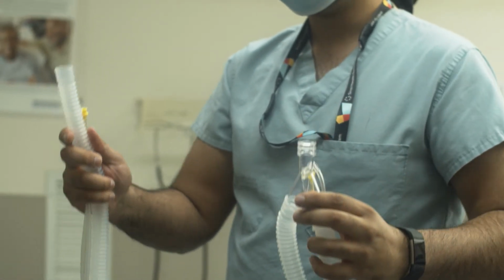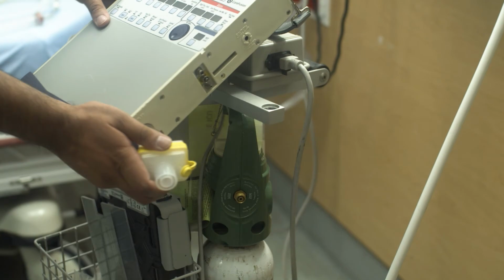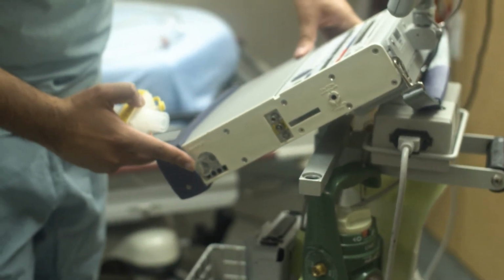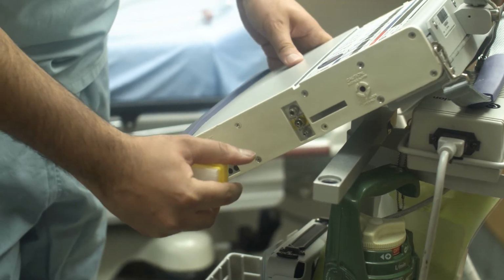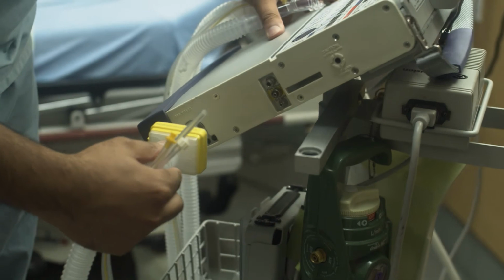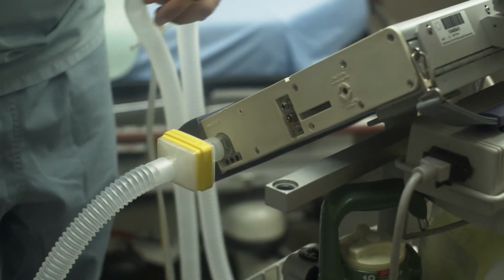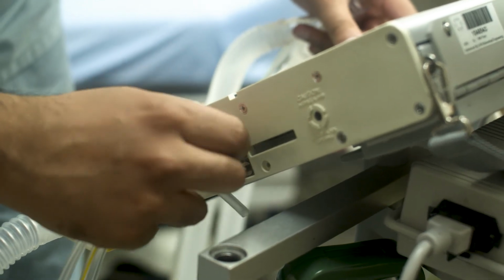This just describes plugging the appropriate tubing and filter into the ventilator. The antimicrobial filter will insert into this port and connects to the main tubing, which can be found bagged in the same storage area you found the ventilator. You'll notice a lot of this tubing can't be plugged in the wrong way, as each side is a different size. There are 3 smaller tubes which attach here.